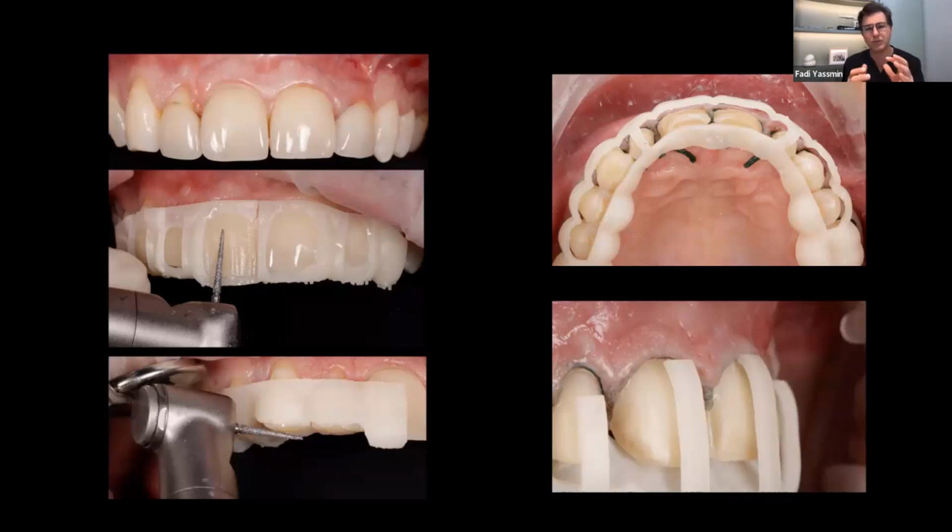We're able to do the beautiful designs and test drive, but now we're able to print these restorative materials so that we can open the vertical, let the patient get used to the ideal new height, test drive the anteriors, a whole lot of that stuff, but being confident with the wear of the materials. So that stuff is going to be amazing.